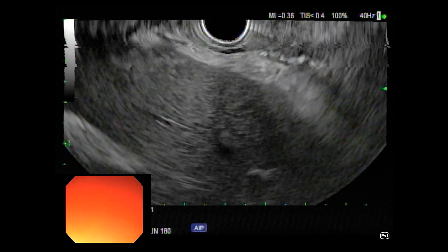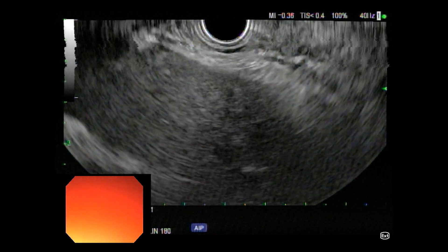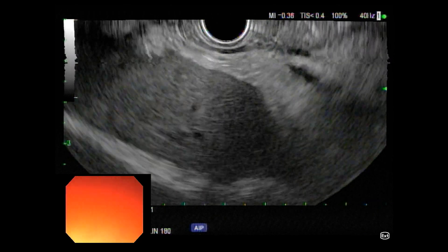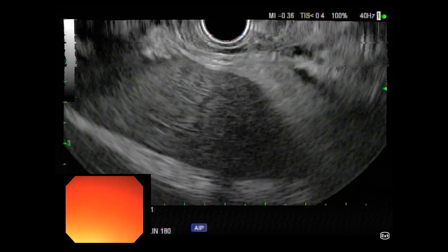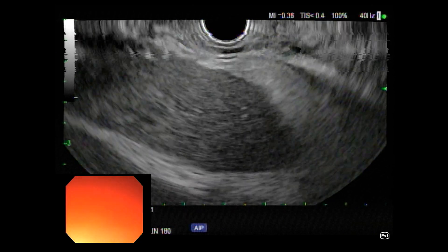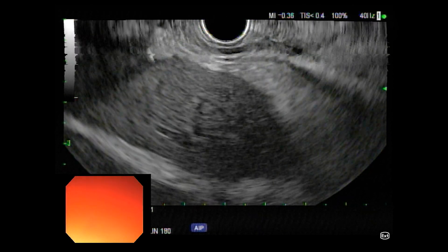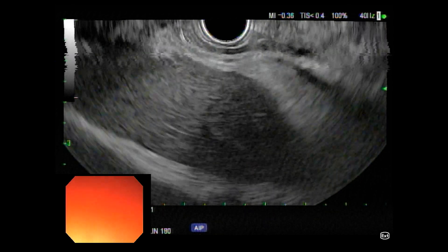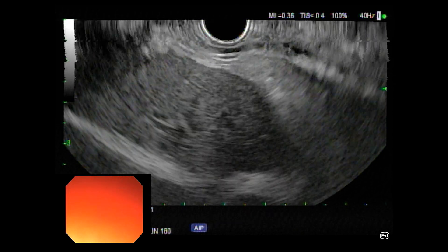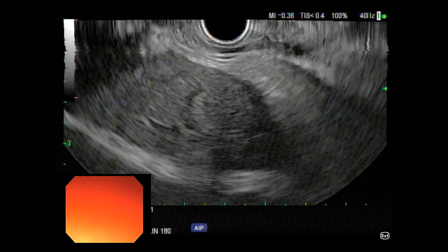This is our first left side. We'll express this very slowly and show everyone the tissue that we have, then move on and do the second pass off camera. This is an interesting dilemma that comes up — definitely in the scenario of liver transplant patients where we do one day ERCP, another day biopsy, et cetera, combining procedures may add significant benefit. We feel comfortable watching Doppler and making sure this is a safe method.